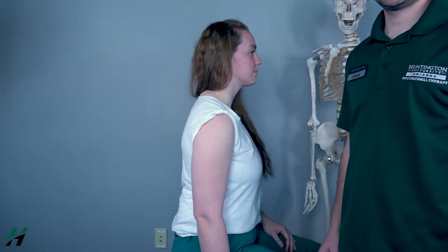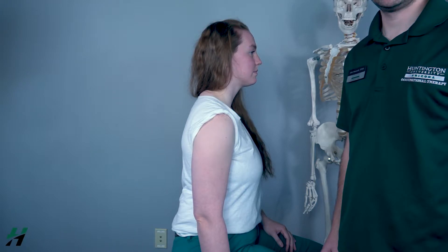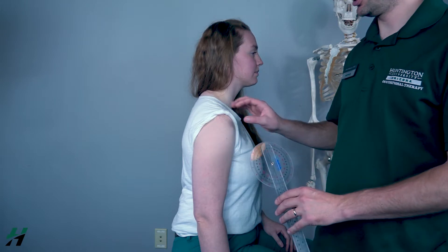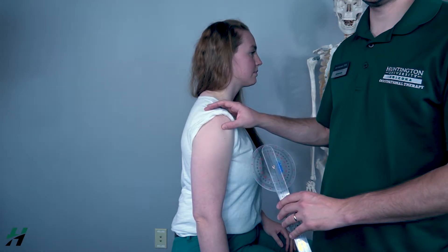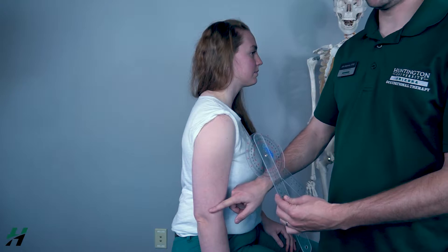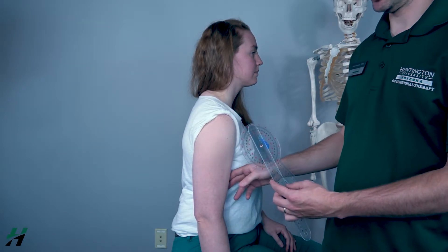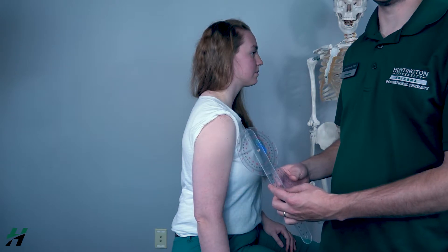Measuring shoulder extension, the patient can be in a seated or prone position. You want the axis of your goniometer to be on the greater tubercle of the humerus, your movement arm lined up with the lateral epicondyle, and your stationary arm lined up with the torso of the body.